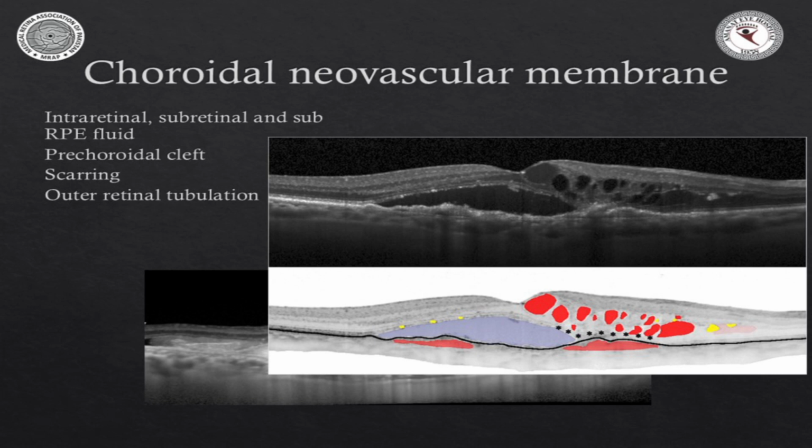I showed it to one person, they said, I haven't seen anything like it. Showed it to another person, they said, I haven't seen anything like it. And these cases just kept on coming, only in cases of very, very advanced choroidal neovascular membranes. Perhaps the reason why they had never seen it before is that in our part of the world, patients present more often with such advanced fibrotic lesions.